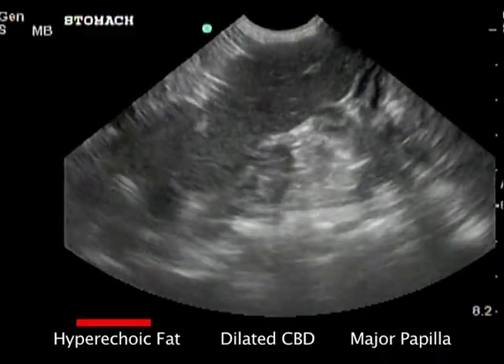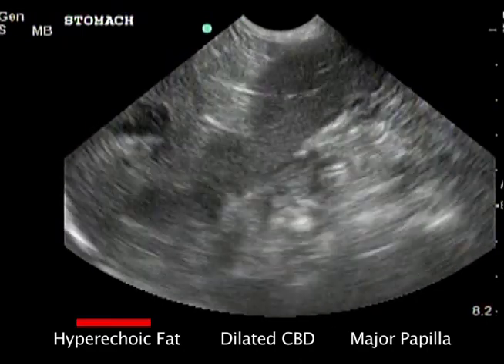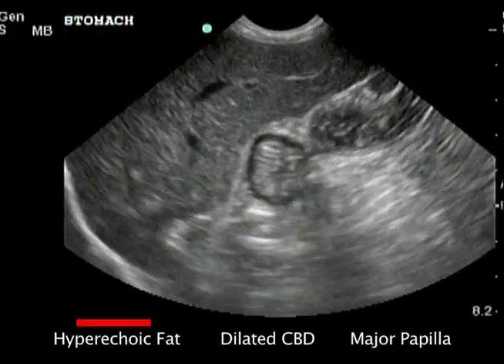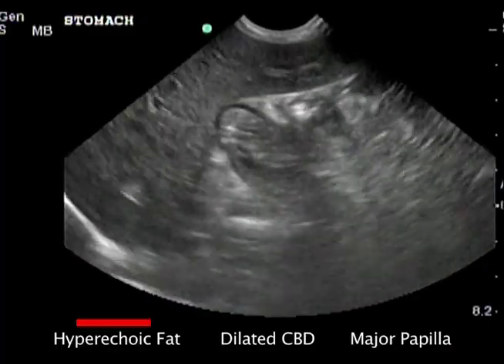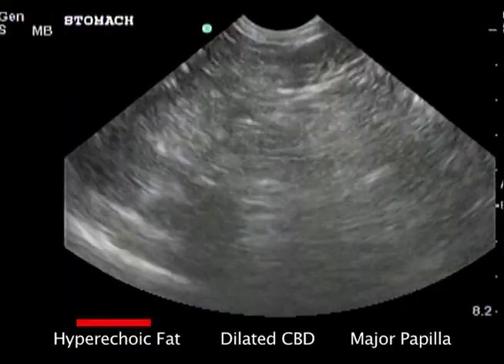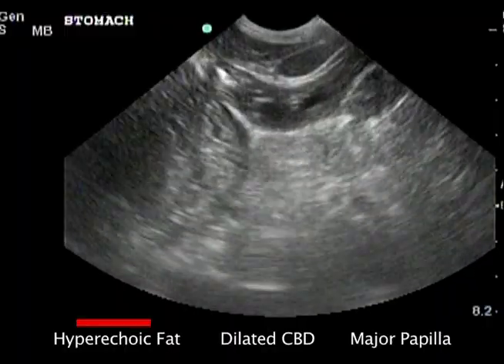Note the hyperechoic fat around the stomach and intestines of this 15-year-old, 13-pound vomiting border terrier with bile peritonitis. Pancreatitis is present, but it is not the primary cause of symptoms. Bile was leaking from a large cyst in the liver. Did you notice the normal stomach contractions?